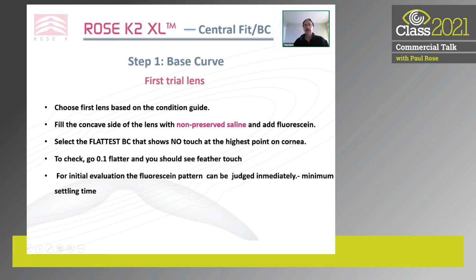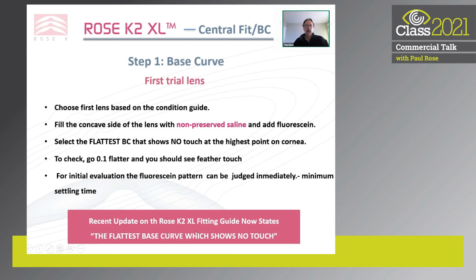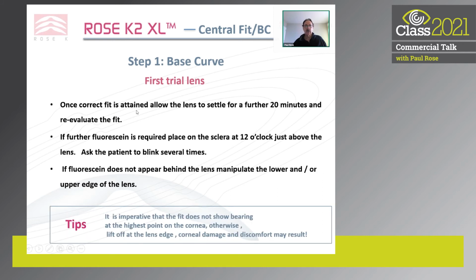You can judge the fit immediately once you put the lens in. There's very little settling time, but do remember, it's in the fitting guide, you're now choosing the flattest base curve which shows no touch. I used to talk about feather touch, but unfortunately, practitioners' interpretation of feather touch was quite different, and sometimes feather touch was very heavy touch. So I now talk about the flattest base curve which shows no touch.